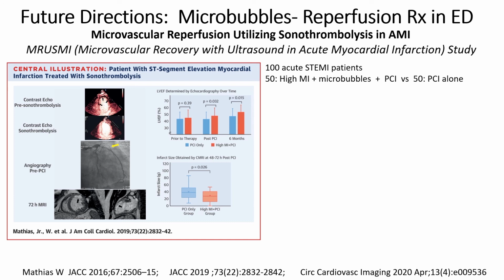And they have been able to improve angiographic recanalization and microvascular perfusion in these patients with acute STEMIs. And as well, they've been able to visualize the infarct risk and reperfusion areas, which have improved. So there is a utilization of contrast echo as both a diagnostic and a therapeutic tool with this technique.